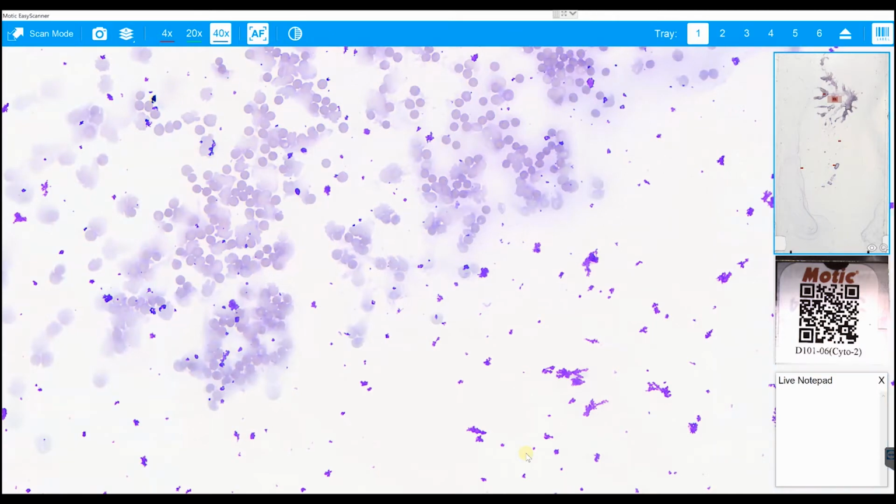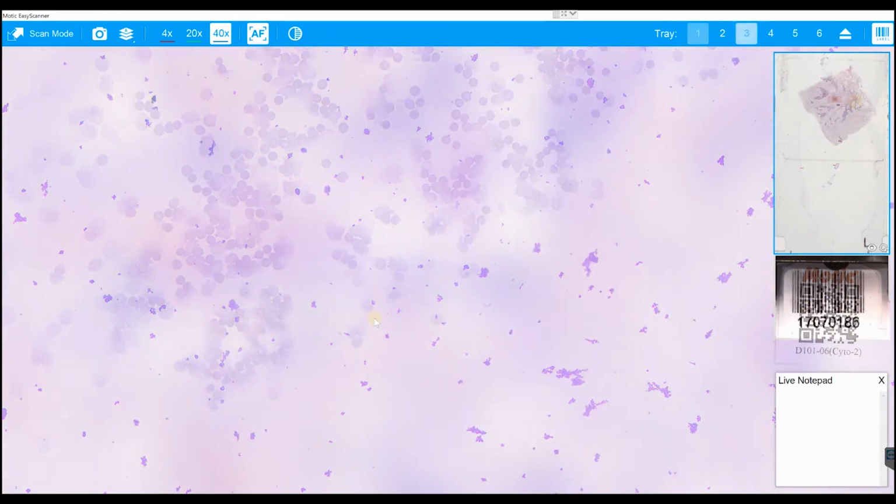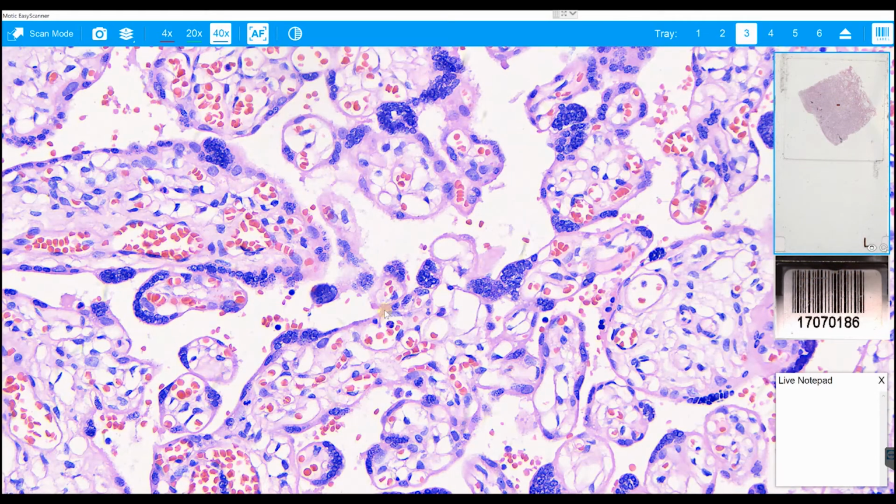Autofocus is a vital tool when changing objectives and viewing various areas of the sample. This is usually left on, but if the user so desires, they can turn this option off with the letter F on the keyboard. At any time when autofocus is on, the user can manually focus by scrolling with the mouse key. Pressing the letter D will refocus any area you are currently viewing.